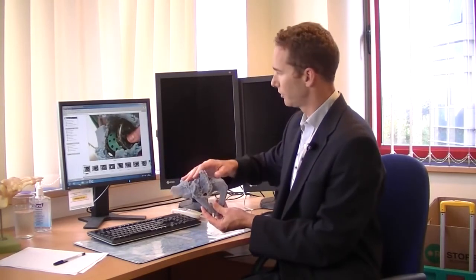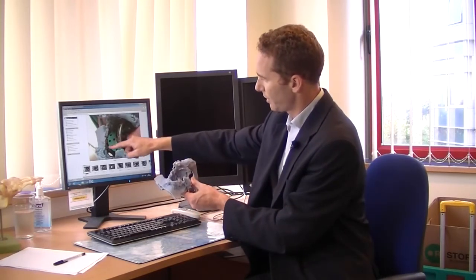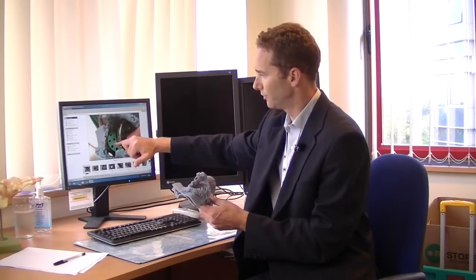So this is the same model that you can see here, turned this way, and these different components you can see are all different pieces which would represent metal that I can use to build up where the bone loss is to create my hip component, that would then finally fit in, which would rest on these metal components to allow a good, solid, stable fixation.